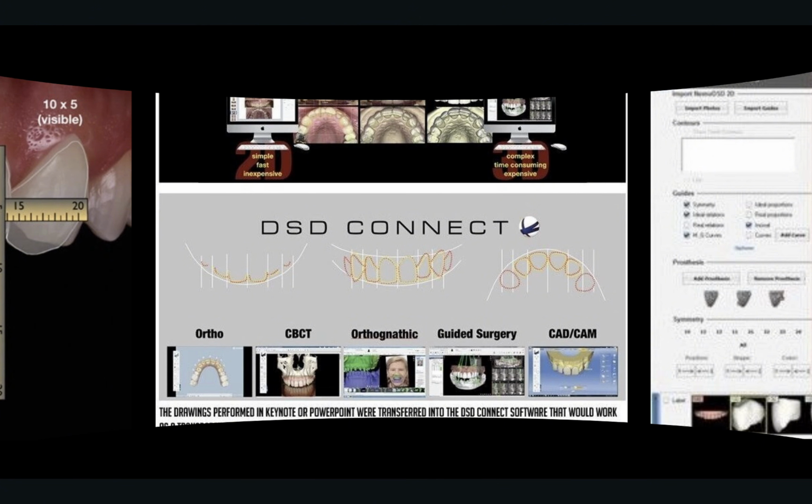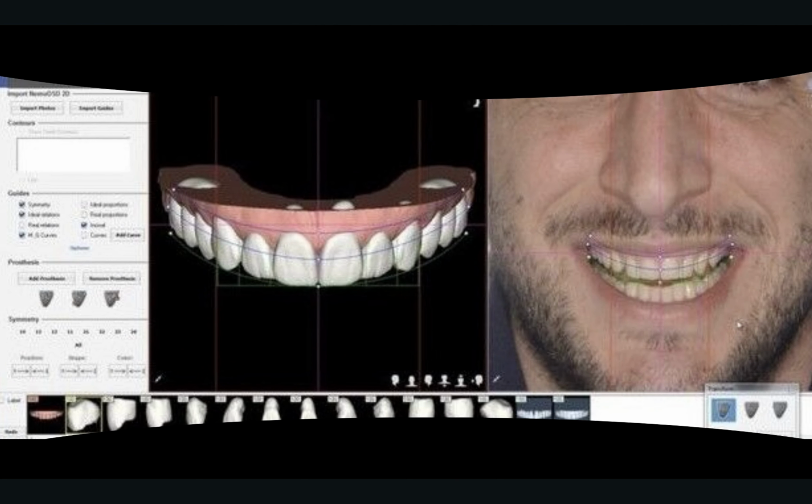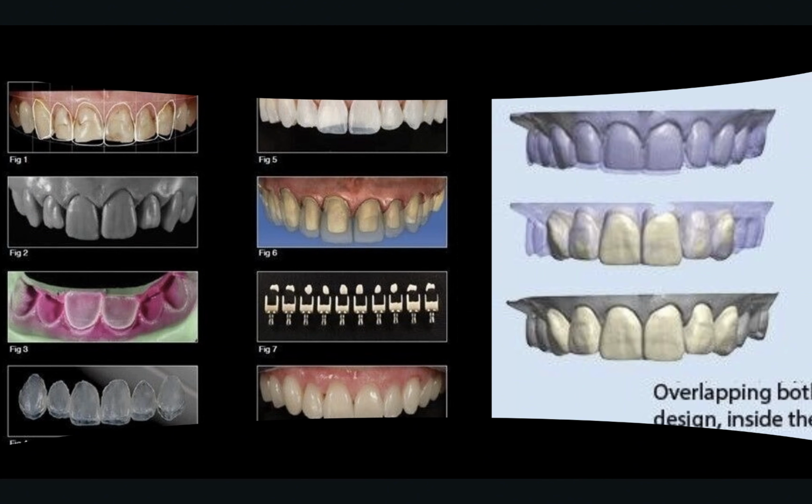Guided surgery was a big change, being able to have that 3D imaging and that CAD/CAM workflow designing and using natural files that we could preserve the fidelity of through fine and detailed milling with monolithic restorations. We had 3D printing, which was a huge game changer, and the changing of that to become something that was more and more affordable to the average dentist. And lab.